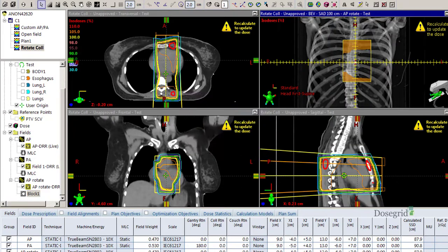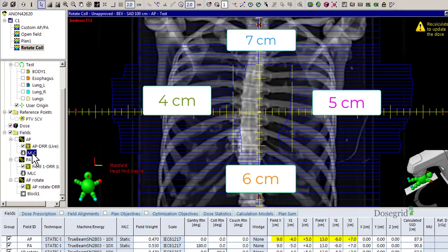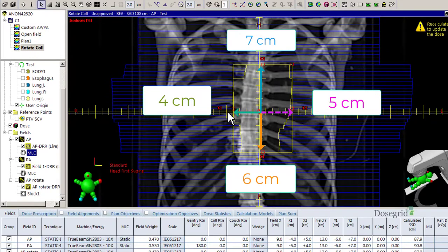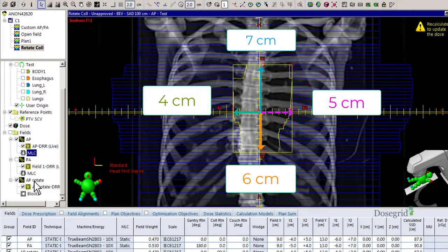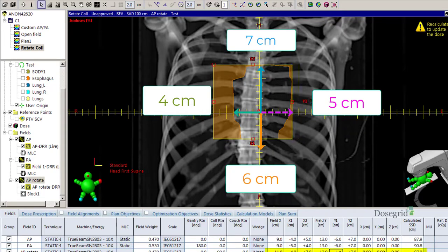Now we have to fix the jaws. Write down the lengths of your original field size so you can recreate them once you turn your collimator. Turn your collimator and fix your X and Y jaws by typing in the corresponding length.